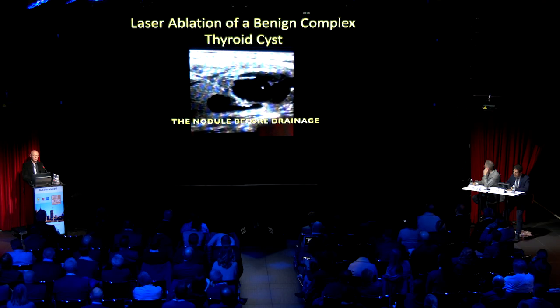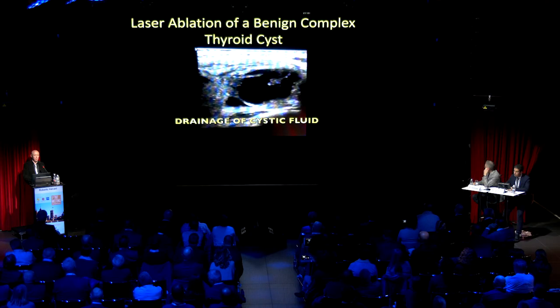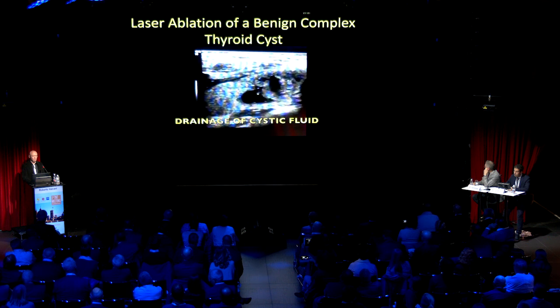Gently, in the first instance, the lower, medial component of the cyst was drained with a G21 needle, the same used for the laser ablation.